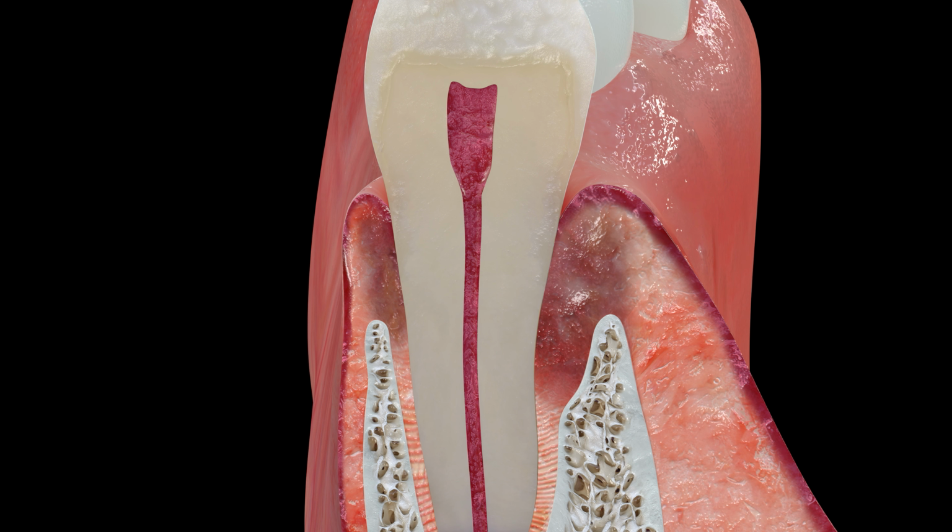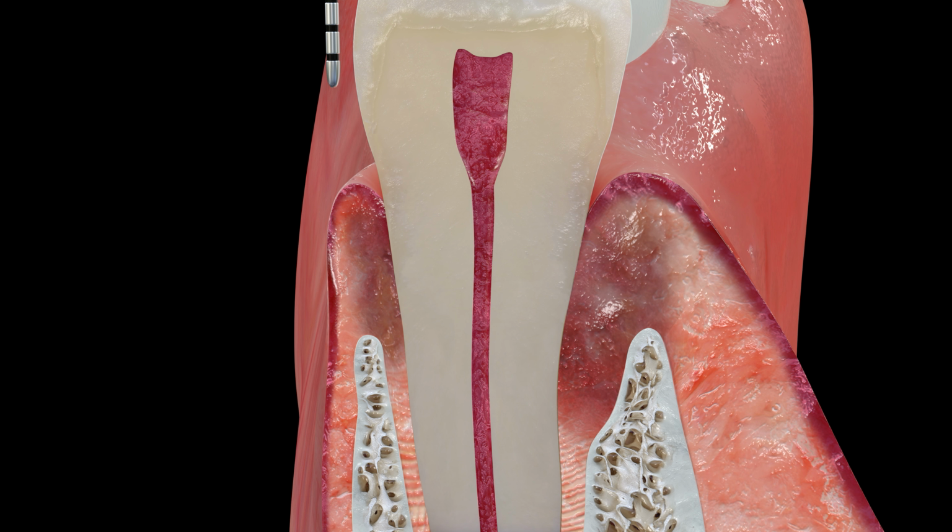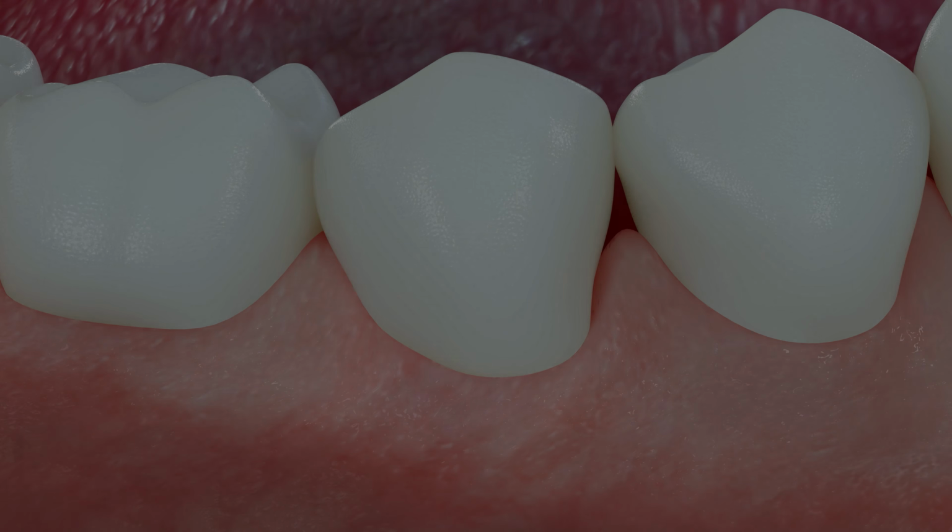After treatment and reduction of inflammation in periodontitis, we may not get the attachment level back to its original level. In this example, probing depth of greater than or equal to 6 millimeters, presence of inflammation, attachment loss, and bone loss signifies periodontitis.